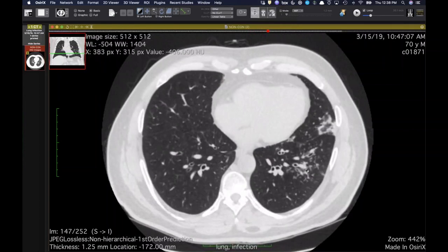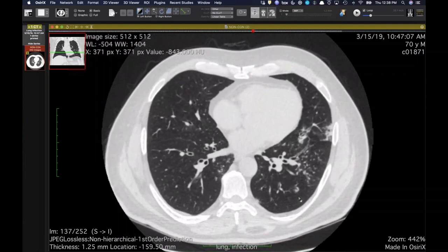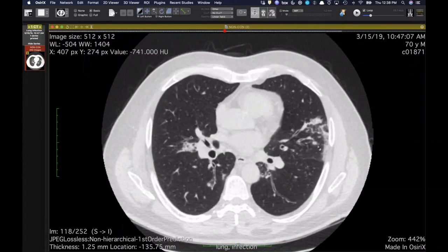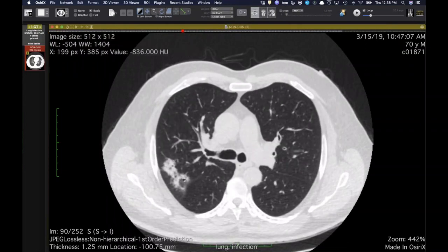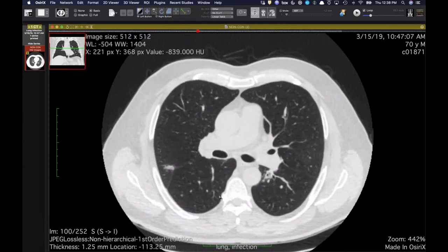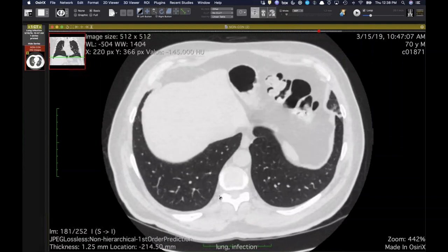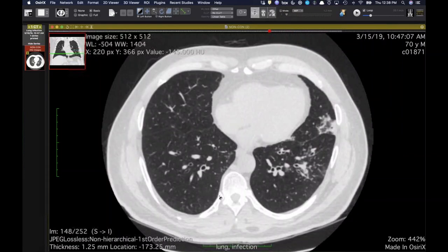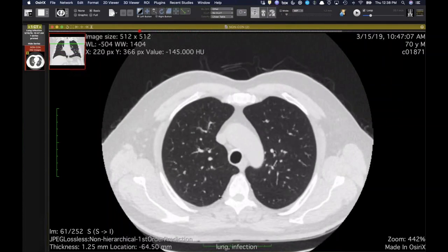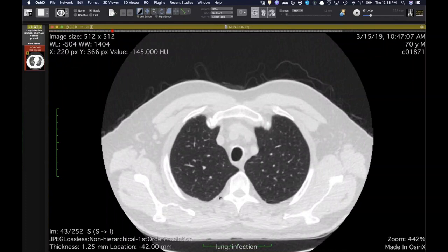But this guy has what looks like an airway-centered infection. He's got a lot of bronchial wall thickening. It's bilateral, very patchy, asymmetric in its distribution. Of course, by this point, he has some areas of organizing pneumonia as well. There's some organization here. You'd probably say that's a little bit of an atoll sign in some of these areas. And this patient tested positive for chlamydia pneumonia. So that's a bug that we often don't isolate. I have very few cases in my teaching file of chlamydia pneumonia like this.